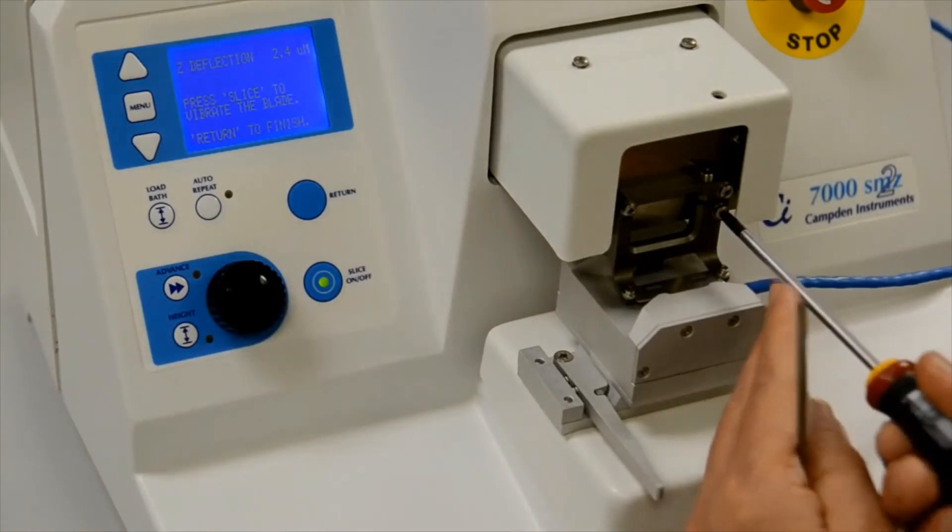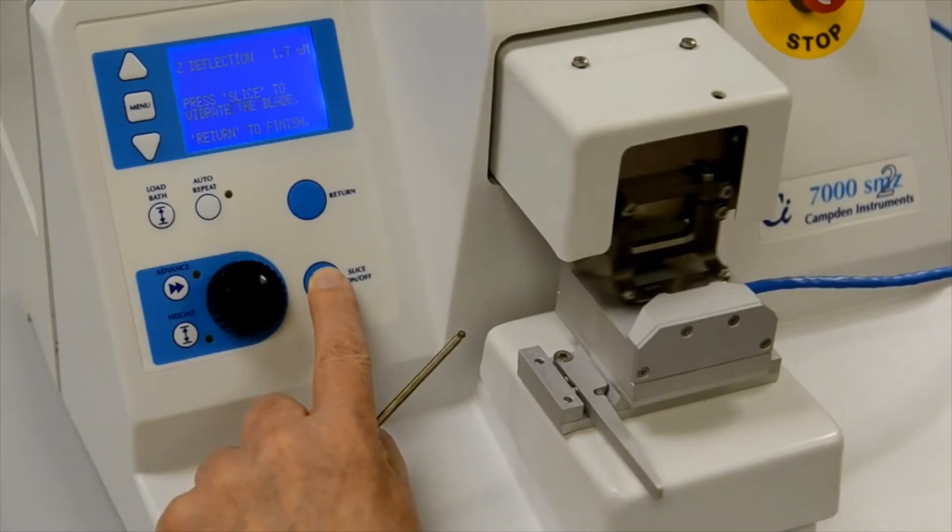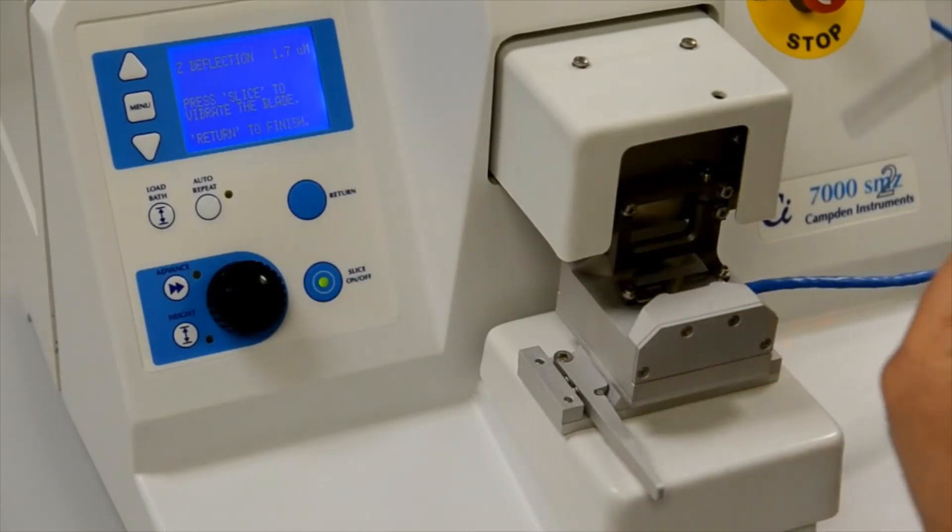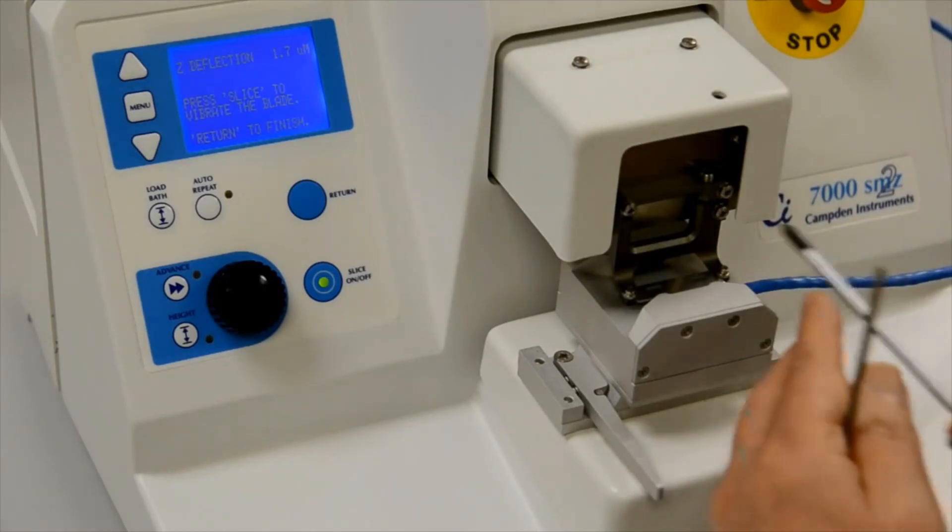If the error has increased, you should turn the adjustment screw in the opposite direction. If the error has reduced, you should turn the screw once more in the same direction. Repeat this process until the alignment error has been minimized.